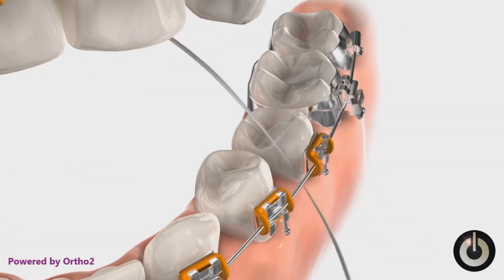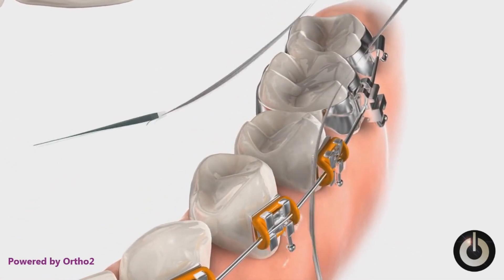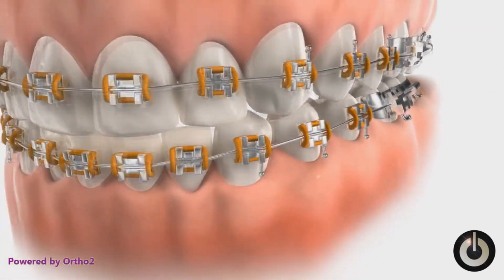For the lower teeth, pass the floss and threader upwards from inside and below the arch wire. Again, be sure to clean below the gum line. Remove the floss and threader.